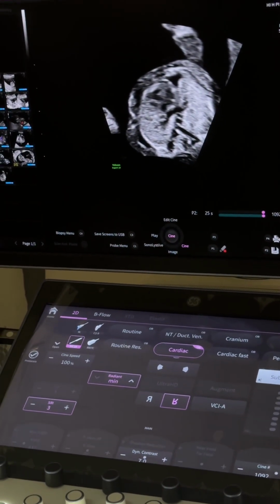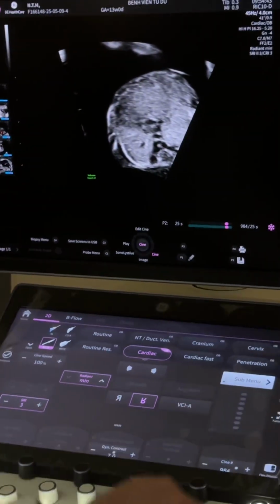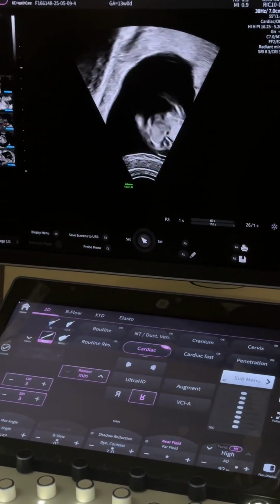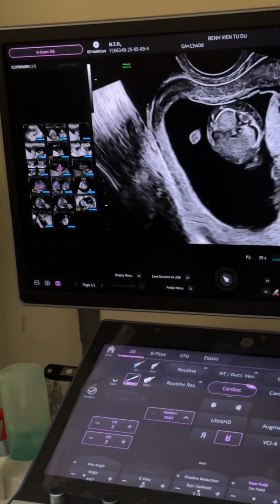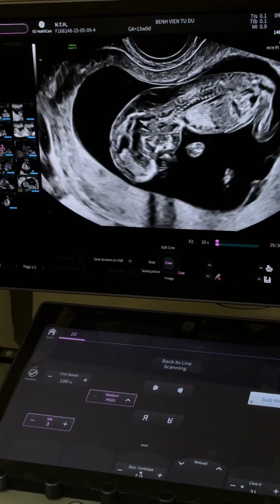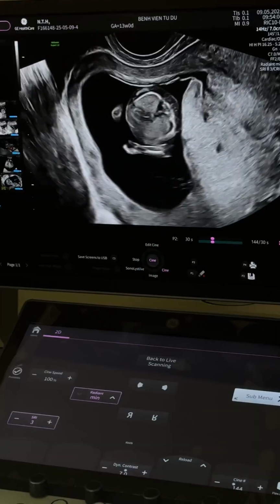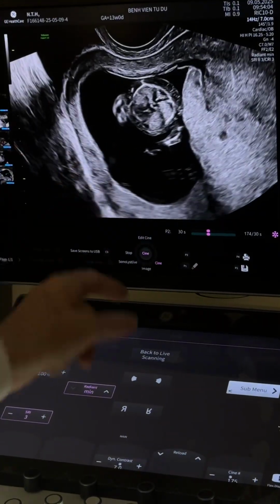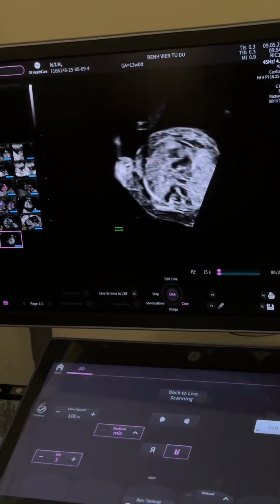So these are the two images. This is the first image I showed you, where the spine was up, and I said to you, you can't see anything in this baby because the spine is up. This is the second image in which you've inverted the spine and you see it. So I'm just making that point.